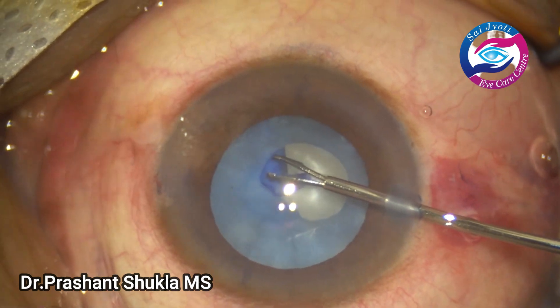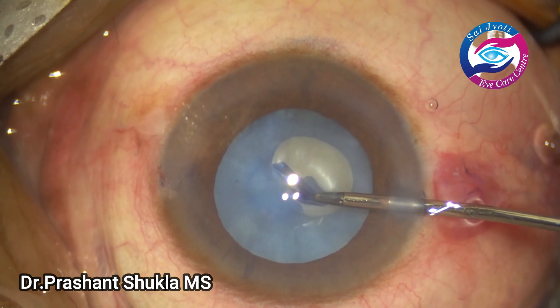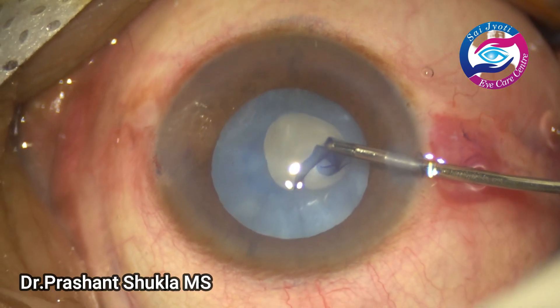I am purposely using the side port and a micro rhexis because I don't want to have a shallow anterior chamber during rhexis formation and to prevent any extension of the capsular rhexis.